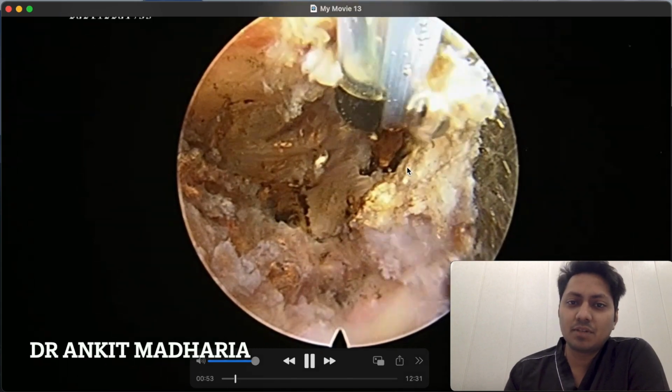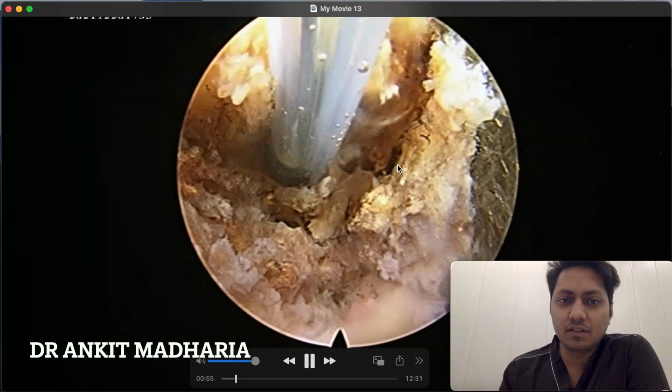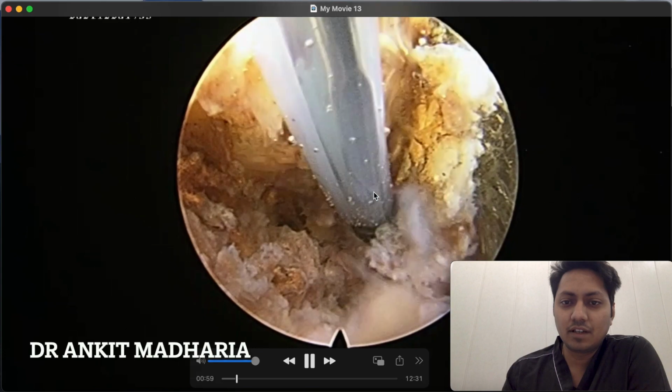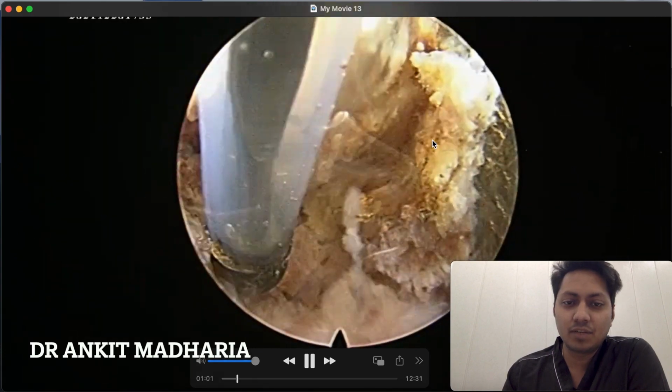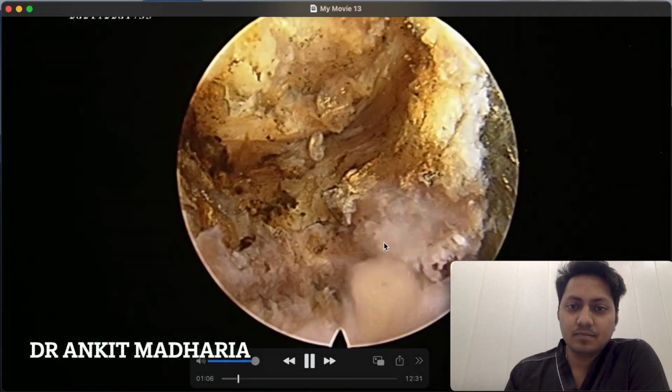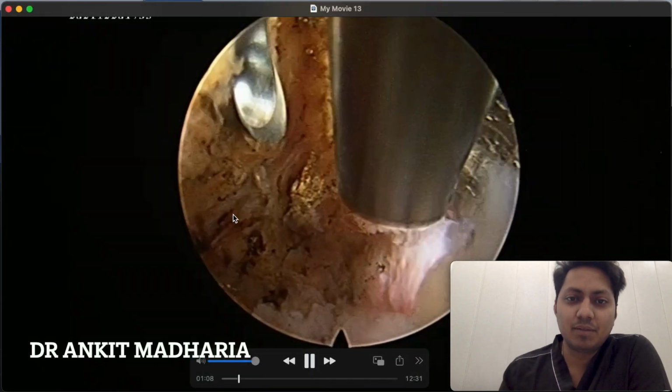Now this is a plasma cautery. It is very powerful, and it has to be used with caution when we are working near the nerve. But since I am lying in the foramen, I am far away from the nerve. I am just ablating and creating a plane.